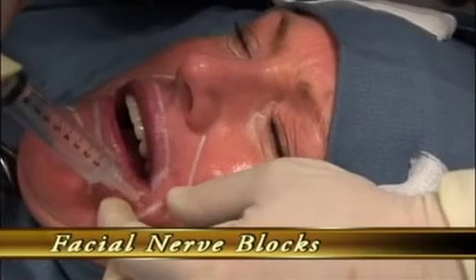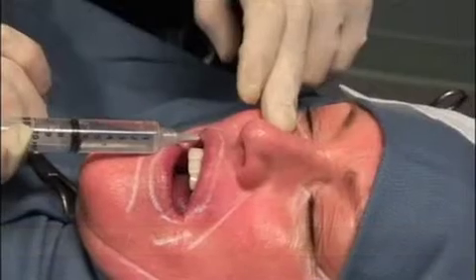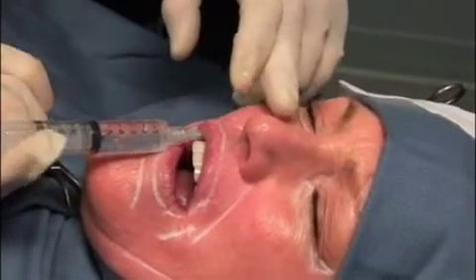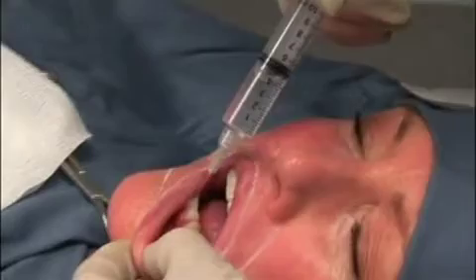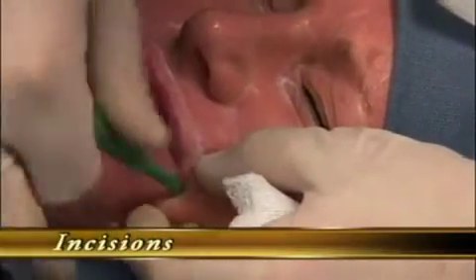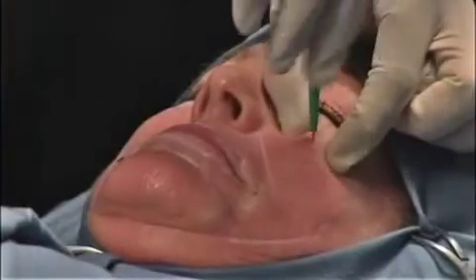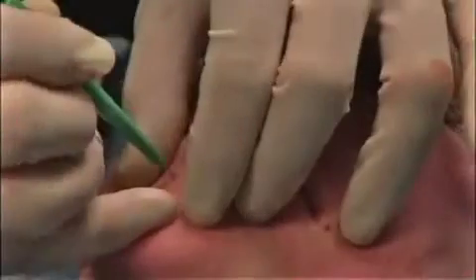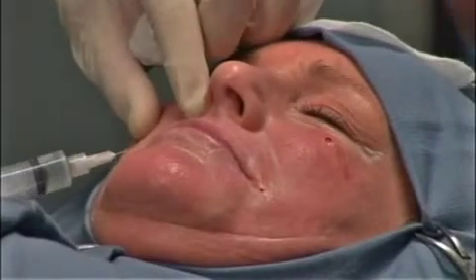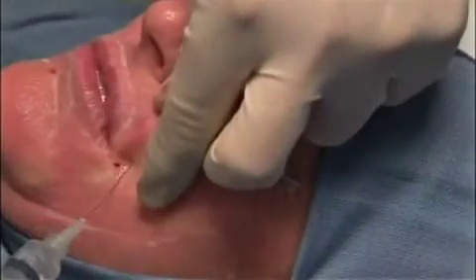In facial fat grafting, the best form of anesthesia is facial nerve blocks. This enables the maximum surface area of anesthesia to the face with the least amount of lidocaine, lidocaine being lipotoxic to the fat cells. Incisions are made with a 1 mm dermal punch. The minimal number of incisions are performed. Classically, the infraorbital area and the inferior aspect of the nasolabial fold are preferred areas. Occasionally, field blocks are necessary, such as above and below the nasolabial fold.